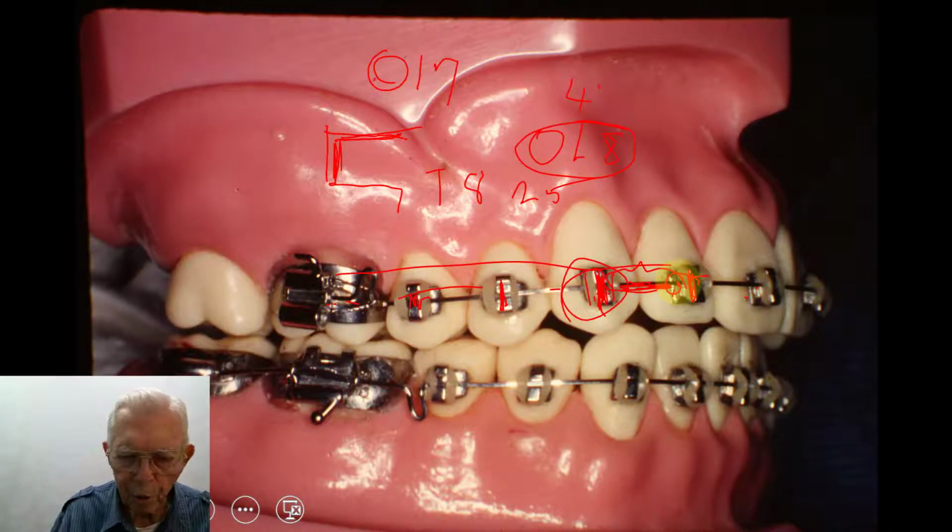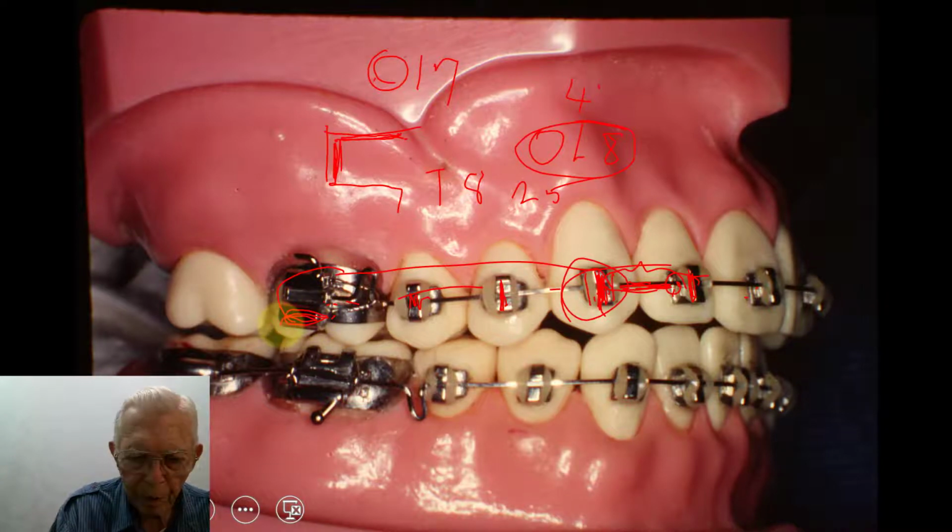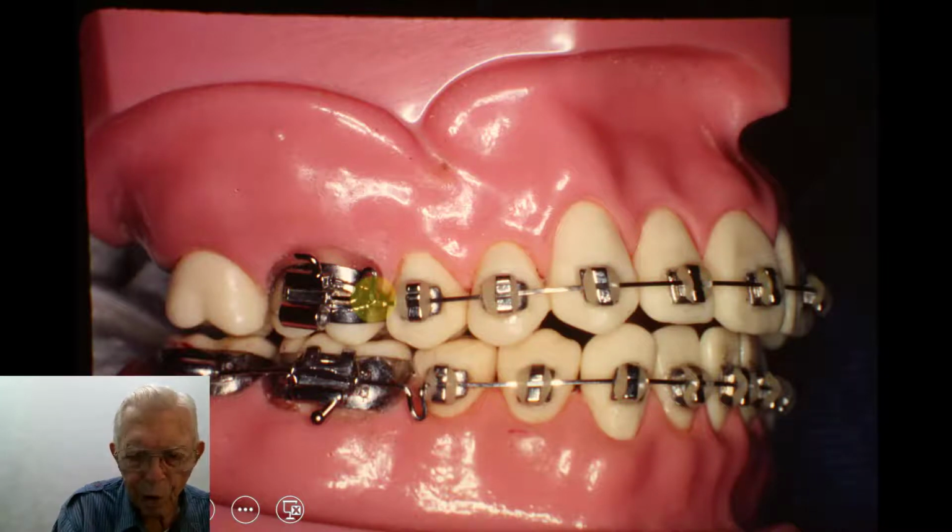Now on our molar teeth, the upper bands, we have 3 slots. There's a headgear slot here that we use for the Big Daddy arch wire, and this slot is where the conventional wire goes. Let me erase that, and the conventional wire would go right in here. This is omega. We run it in there.